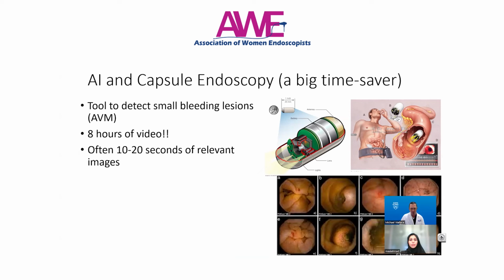Before we finish up, I want to talk about some other very obvious applications, not directly in the flexible endoscopic space, but in the capsule endoscopy. This is where it may turn out to be a huge time saver.